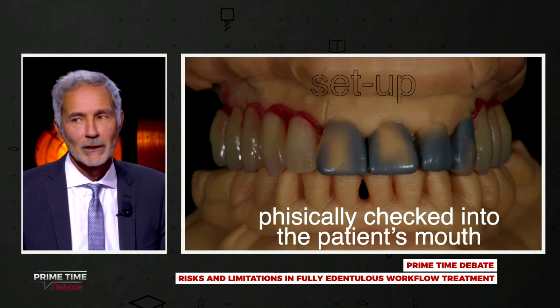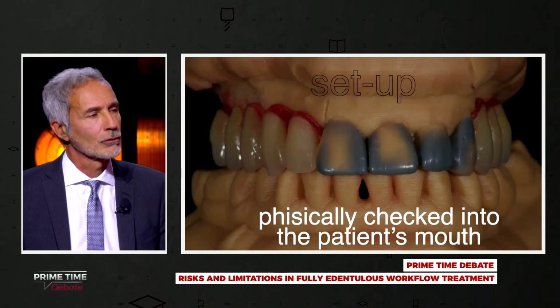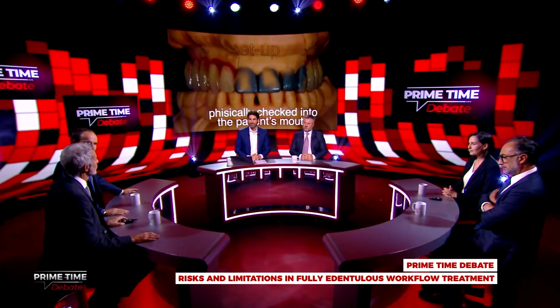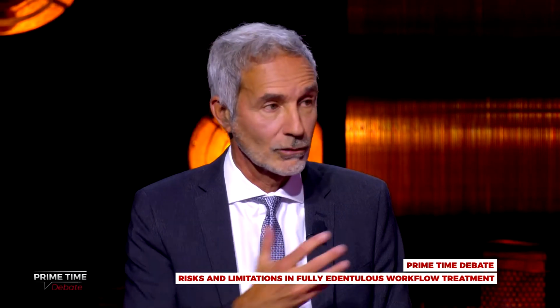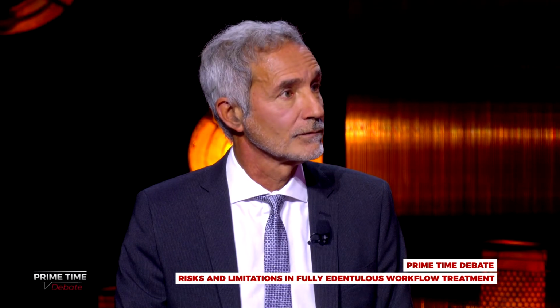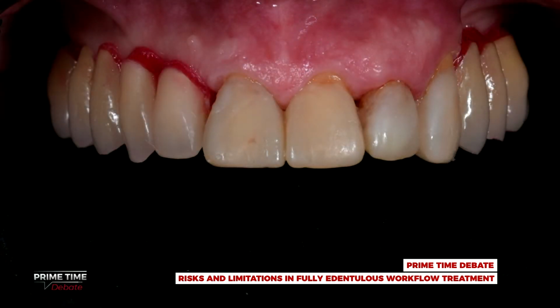So, in my opinion, we cannot have a perfect full digital workflow from A to Z, because, for instance, in this phase, we need this type of visualization. There are some teeth in the patient's mouth, so we cannot extract them to have a perfect setup. We need a visualization of the frontal teeth, and then we add the setup in order to have the perfect idea of what we need in this patient's mouth.